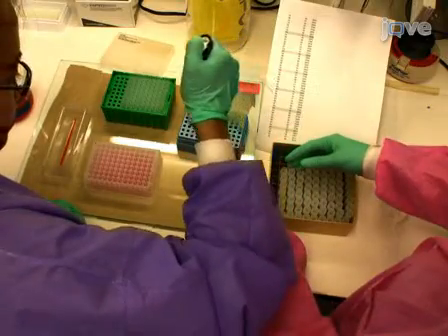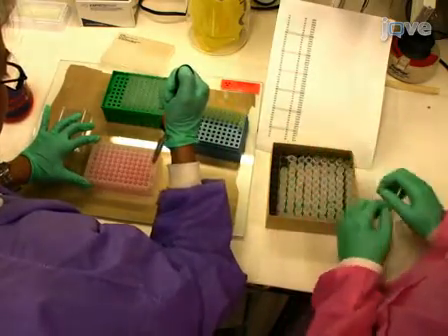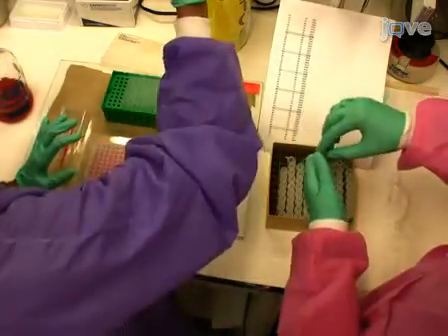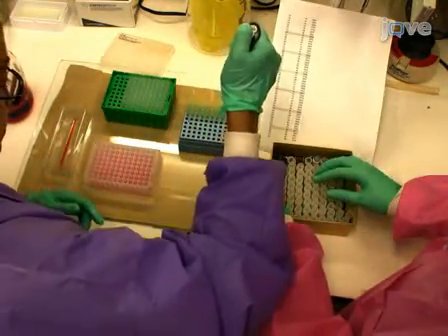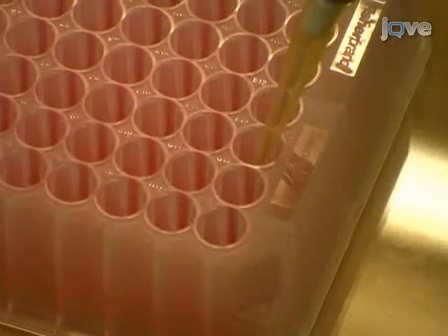Next, add 50 µL of sera from each sample to each well containing 450 µL of buffer A. Note this is a 1 to 10 dilution of the sera in buffer A. Typically, sera is not added to the last two wells of the master plate because this is reserved for the buffer blanks.